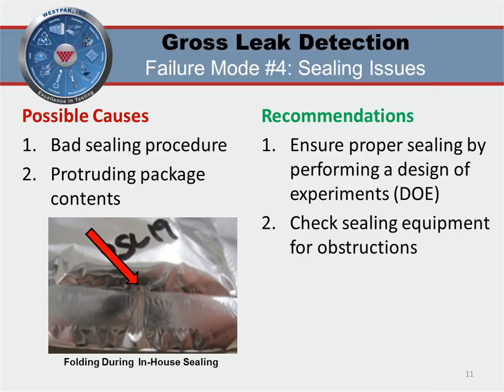Greg, do we have any quick questions before we move on to dye penetration testing? Yes, we have a question from Salvatore. If you are folding pouches, is it better to have the clear film on the inside or the outside of the fold radius? One of you guys got that one? Eric, you got that? So is it better to fold the film on the inside or the outside?